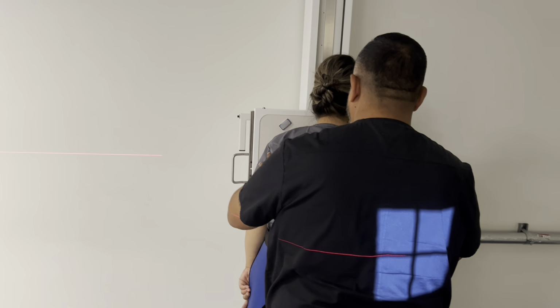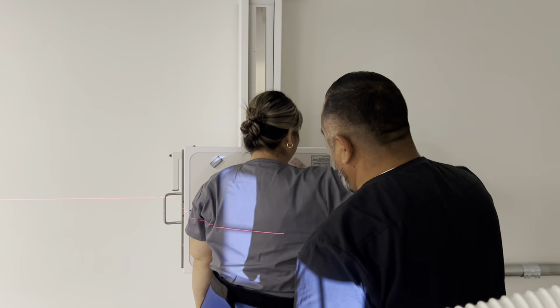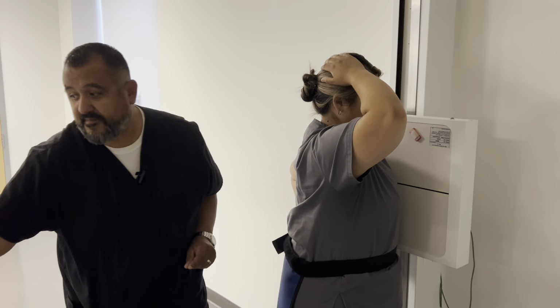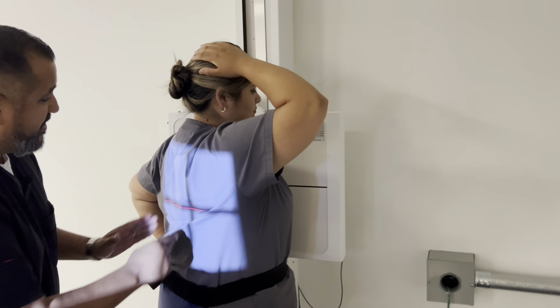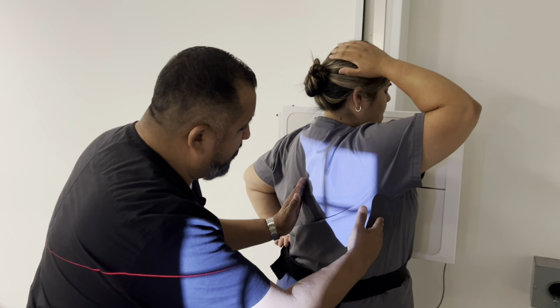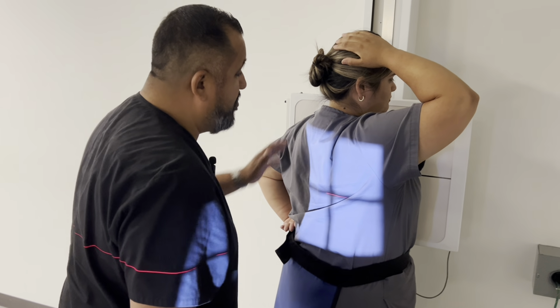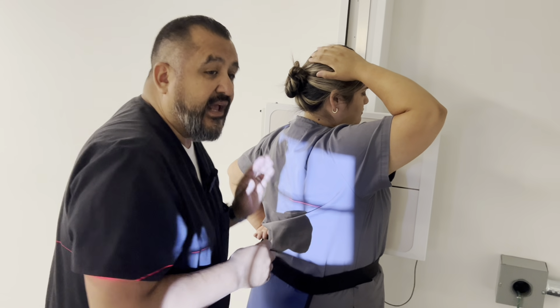We're going to turn into an LAO position here now. 45-degree rotation. You're going to bring this arm up. This arm's going to be bent, just like this here. 45 degrees. Okay, so now you're going to have the central ray right back on the inferior angle of the scapula. Again, you guys, here's the spine. Here's the elevated axillary portion of the rib. You're right in between those 2 points. So right here, you guys, this is going to be an LAO. You would turn on the right upper chamber here because you're doing an LAO position for the right lung.